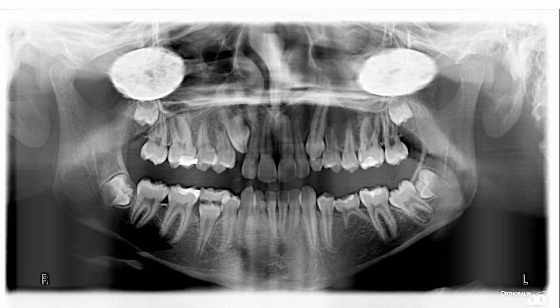For example, if you're suspecting a large lesion, or if you have extensive dental or osseous disease, that can be useful. Tooth development, eruption, retained teeth or root tips, TMJ pain, that's a good exam. But like I said, there are so many indications now, and you'll have so much more detail with the CBCT that in some cases you will go straight to the 3-dimension and skip the pan by itself.